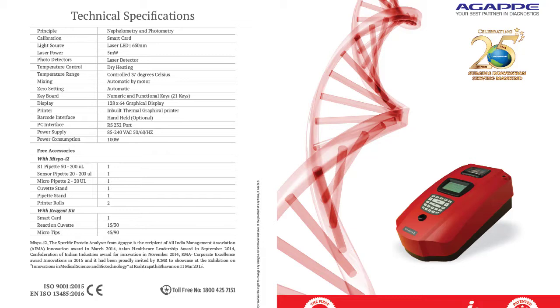Hello everyone, assalamualaikum. As a MCL program, this is a protein analyzer — the MISPA i2 Agape, made in Switzerland. It is a protein analyzer.